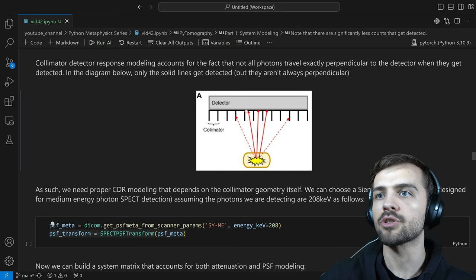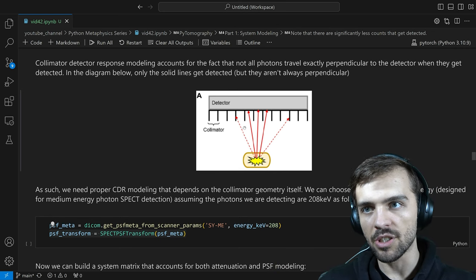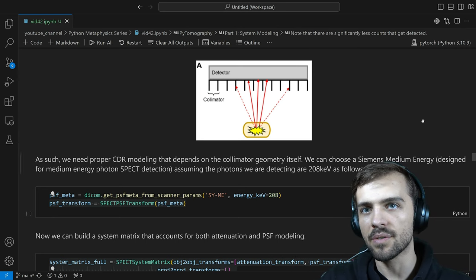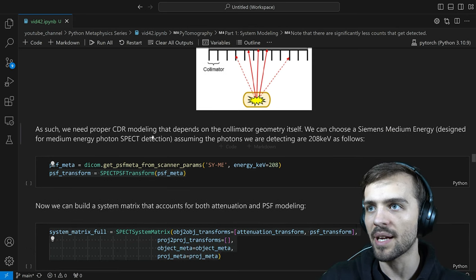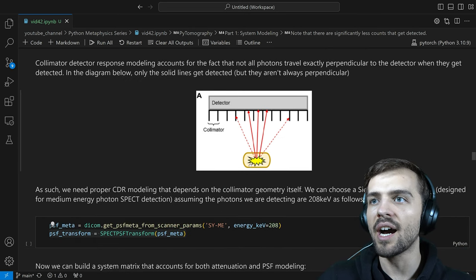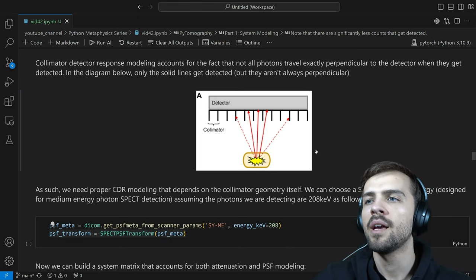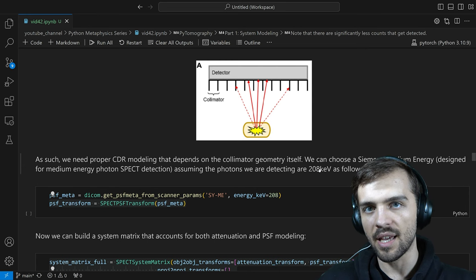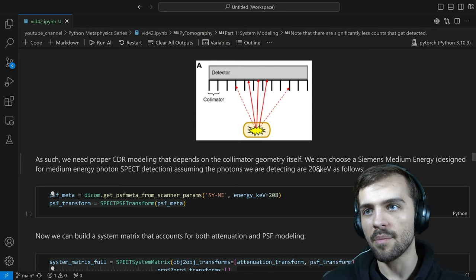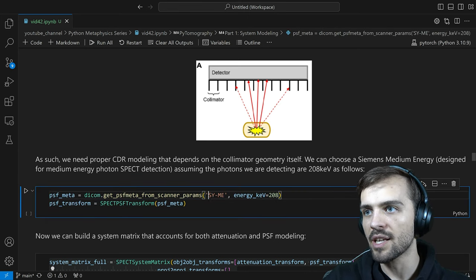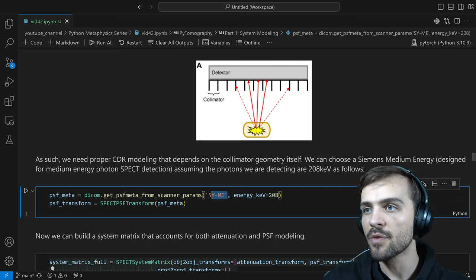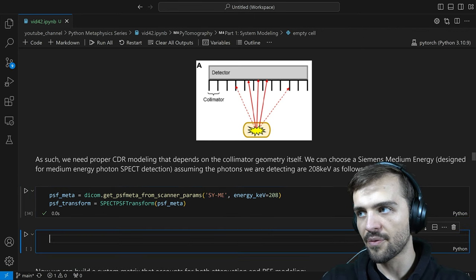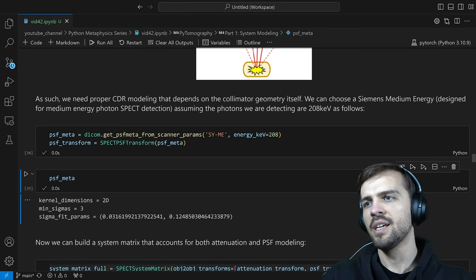The PSF depends on the collimator geometry. There are different collimator geometries for different SPECT imaging systems. In this case, we'll choose a Siemens medium energy collimator — SY-ME — which gives wall width, number of holes, and similar parameters. This is designed for medium energy photon SPECT detection. You also give the energy of the photons you're detecting — higher energy photons are more likely to penetrate the lead and change the blurring. We'll give 208 keV, representing a Lutetium-177 scan, whose main photon has an energy of 208 keV.